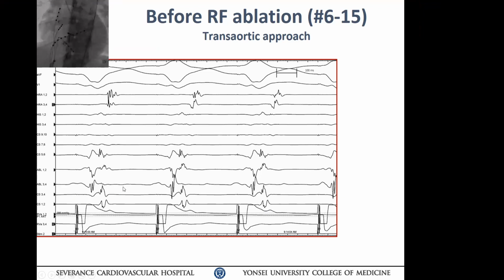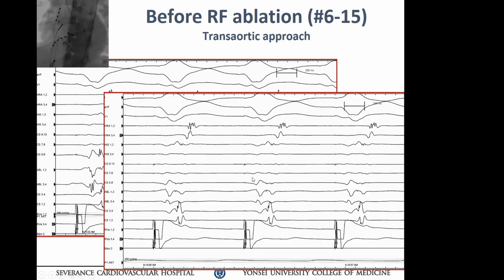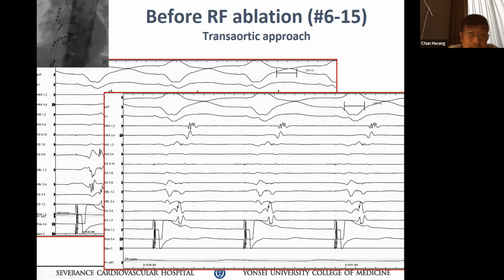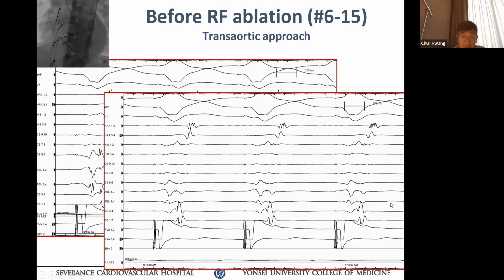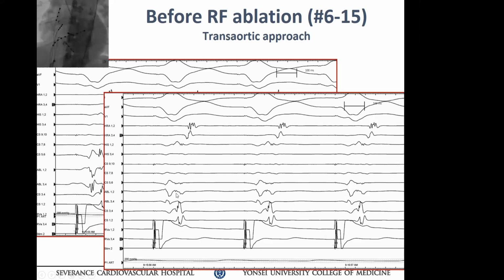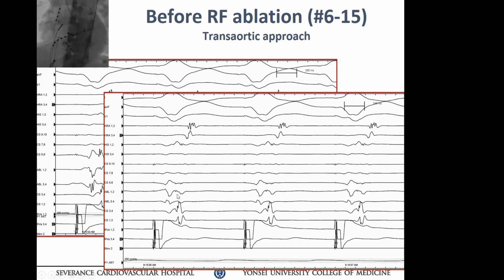어블레이션도 비페이싱 하면서 했어? 네 시행하고 나서. 오케이. 너무 다양한 위치에서 많이 해가지고요. 각 위치에서 대표적인 시그널들을 하나씩 일단 가져왔고요. 이거는 아니, 대표적인 시그널이 어딨어? There's no such a thing. Ablation, pathway ablation 하면서 대표적인 시그널이 어딨어? Actually, pathway potential 있는 게 시그널이지. 그래서 이게 이제 그 맞는 시그널이야? 이거 어블레이션 한 시그널이야? 이거 한 사이트야? 한 번만 들고 왔습니다. 어블레이션 직전에 시그널입니다.